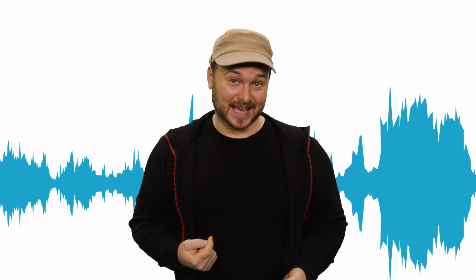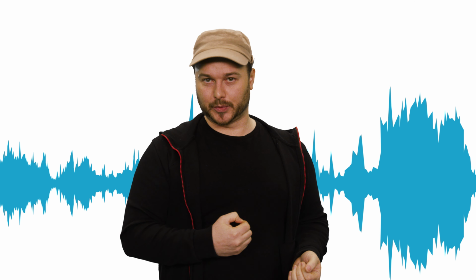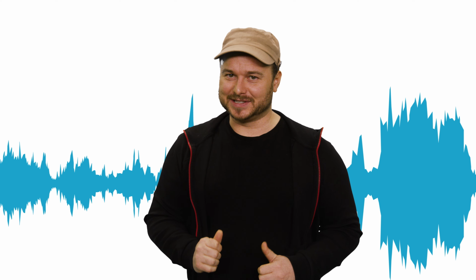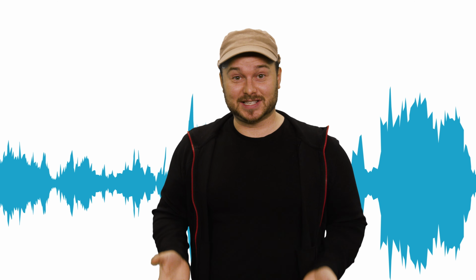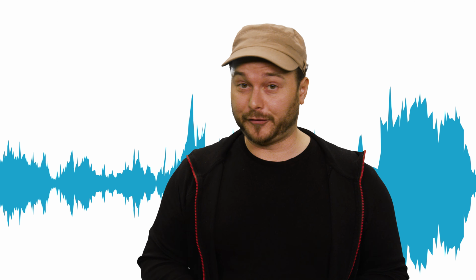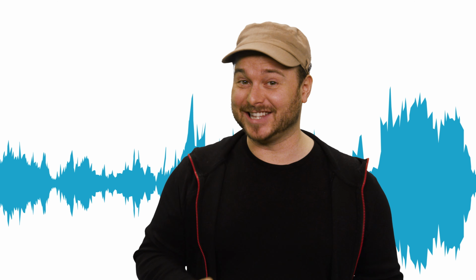This means that in my case, I can make that left audio louder than the right. If most people heard what I listen to, it would be completely off balance for them. But in my case, it actually sounds like proper stereo. So that's just a few ways that technology can actually enhance your hearing.